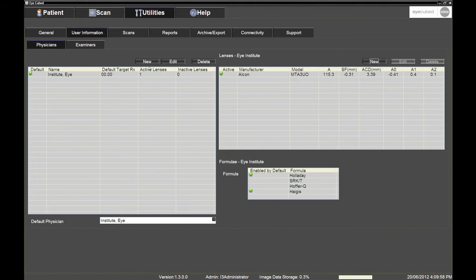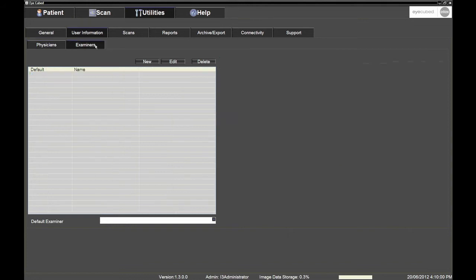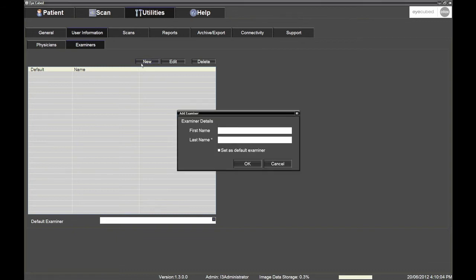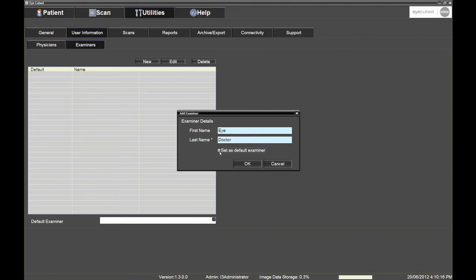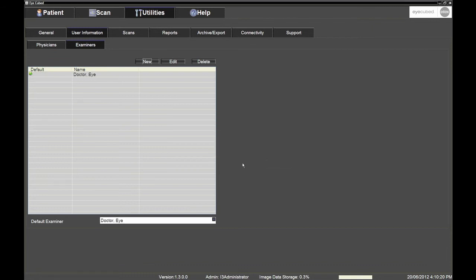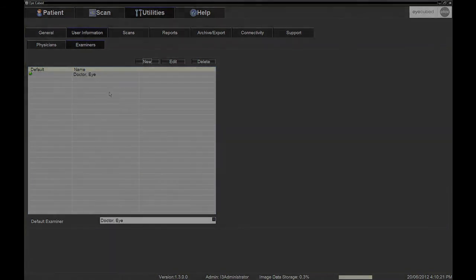In the Examiners tab, you have the option to nominate all the different physicians and or technicians who will perform examinations for the iCubed by clicking the New button. Also, make sure that the main user of the iCubed is set as the default examiner. This will save time when creating new patient sessions.